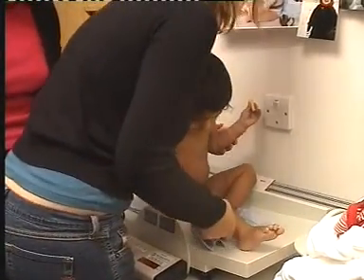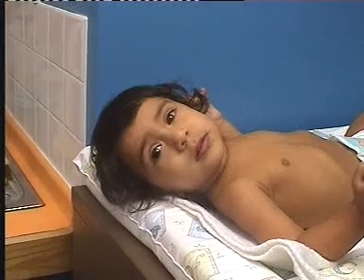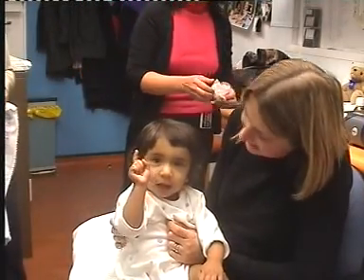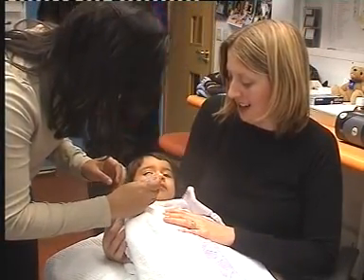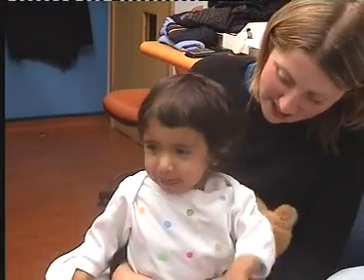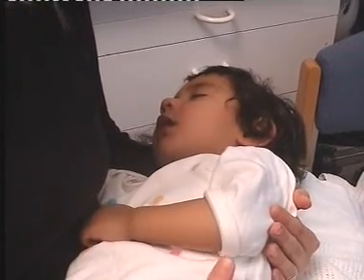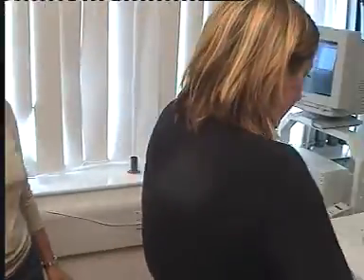Soon after arrival, the child is undressed and weighed on calibrated scales. A physical examination, including oxygen saturation, is undertaken to check well-being. Babies are less likely to fall asleep if they are hungry, and it is not usually necessary for the child to be fasted prior to testing. Chloral syrup is given orally via syringe just prior to a light feed. Following sedation, the child is given a drink to settle and then allowed to fall asleep. The time taken to fall asleep can vary between 15 minutes and one and a half hours, during which the baby may become slightly hyperactive or irritable.